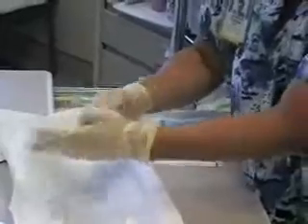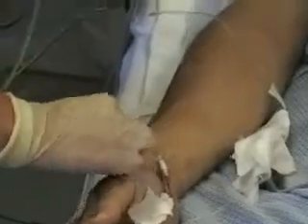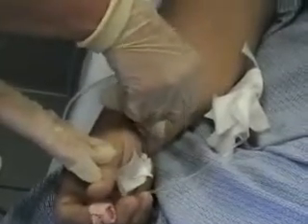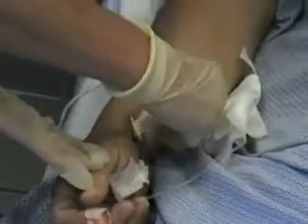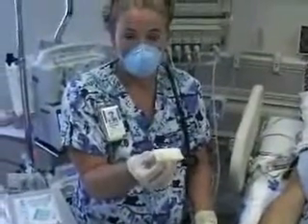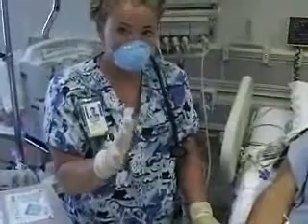This is saturated already because we broke the ampule. We're going to take alcohol and clean the area — a little sting — prior to removing it, starting at the inside and moving outward. Then take the chloroprep, starting inward and moving outward once again. We'll give this at least 30 seconds to dry after we put this on. You're not supposed to blot it; just let it sit. That goes with all of our central line removals: first alcohol, then the wipe, 30 seconds to dry.